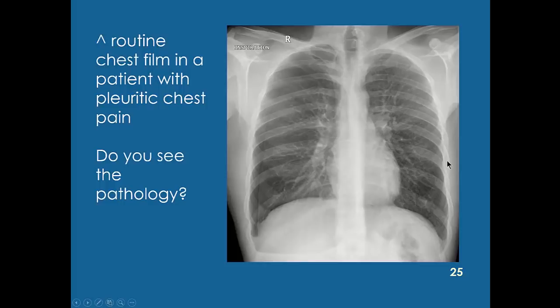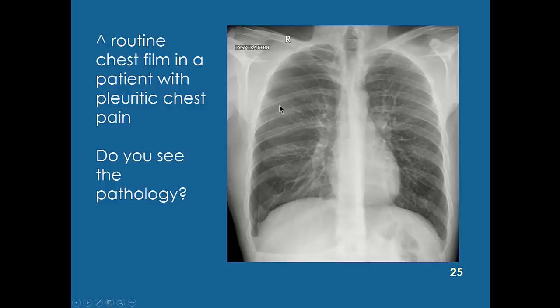Notice the lung tissue on one side has normal vasculature and bronchial tree visible, but on the other side that vasculature is gone. If you look closely, you can see a line — that's the collapsed lung. The patient has a pneumothorax, where a bleb or small hole in the lung caused air to leak into the pleural cavity, the space between the chest wall and the lung, squishing and collapsing the lung.